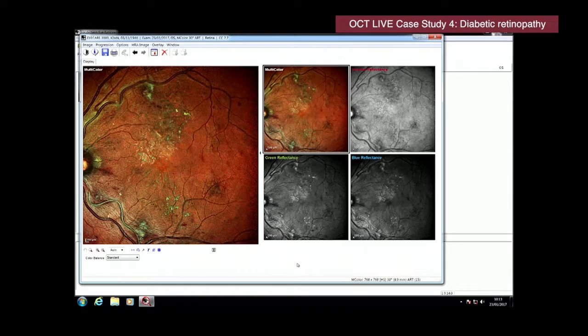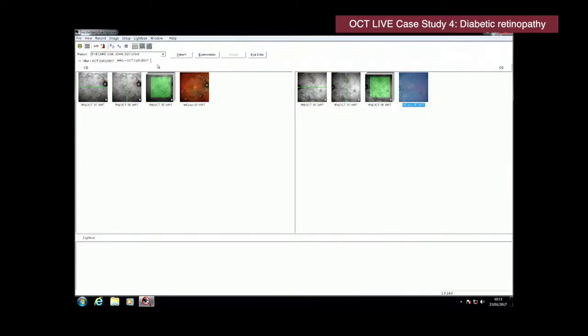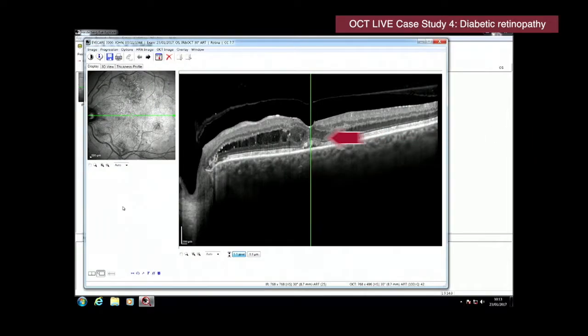And we'll have a look at the OCT scans that we performed, Phil, very quickly because we are running out of time. And we've been reminded. Okay, and again, we're seeing evidence of intraretinal fluid, again in the nuclear layer, in the outer plexiform layer, anterior to Henle's fibre layer. And we've got a little bit of subretinal fluid here and some macular thickening.